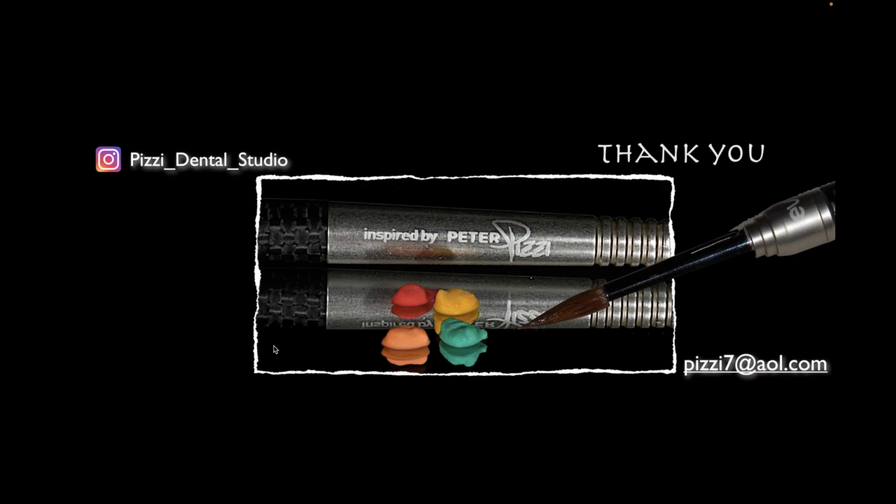Well, thanks, Peter. You covered everything I was expecting, so I appreciate that. I know some people still use foil. It's not used that much because we have all those alternatives, right? Milling, and then we also continue to do refractory, which a lot of people are using as well. So one of the first questions we do have is, as always, what refractory material do you use?